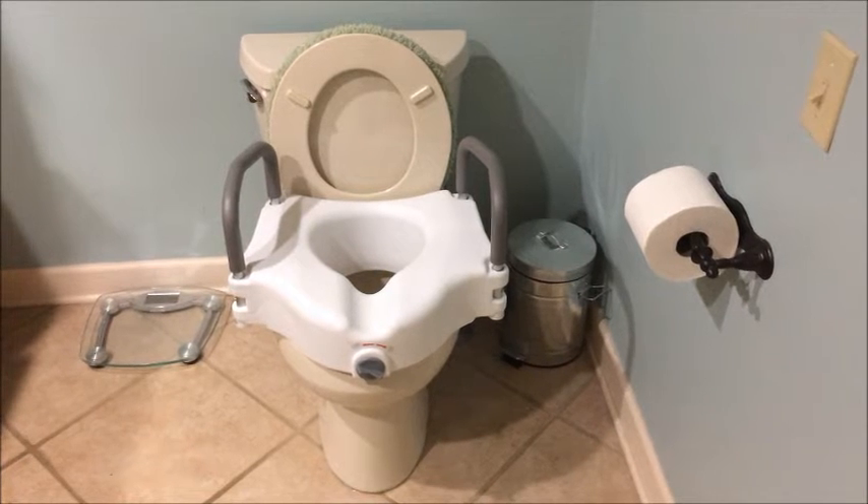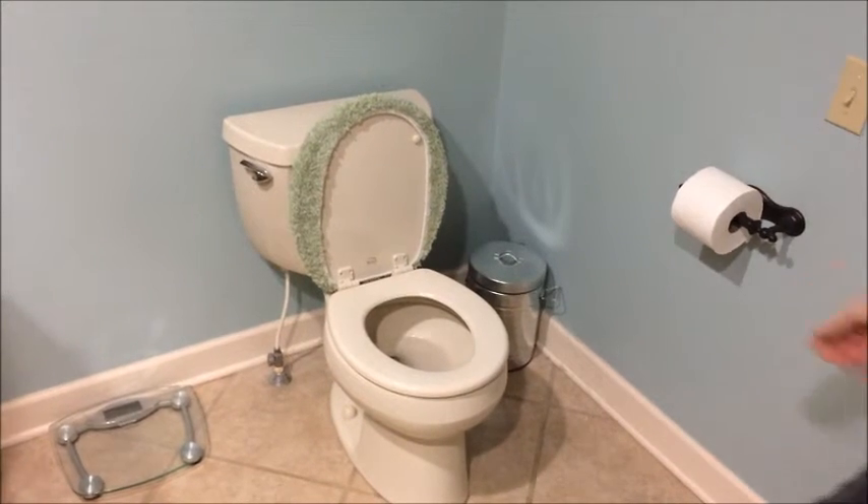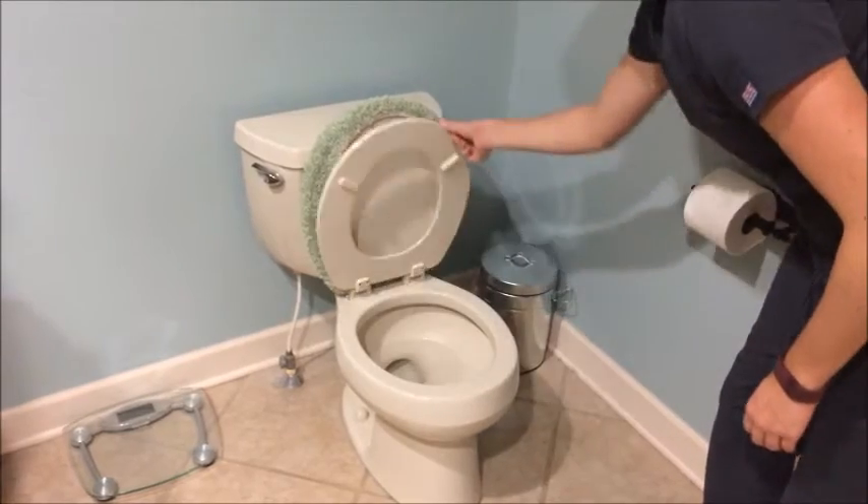The raised toilet seat decreases the distance needed to get on and off the toilet, making it safer and easier. To install, first lift the lid and seat of the toilet.